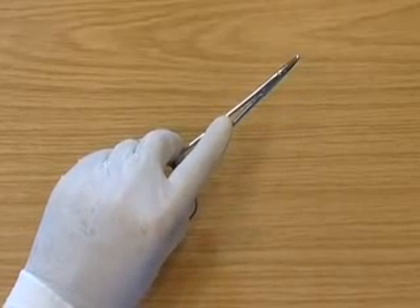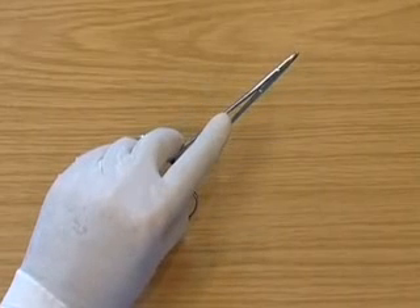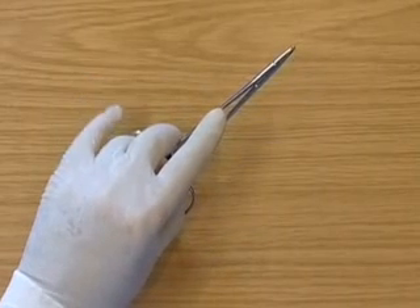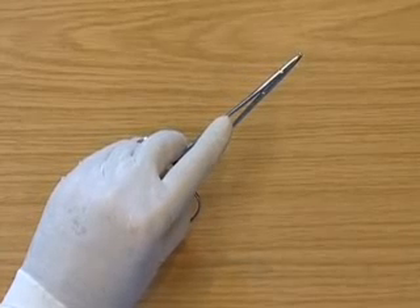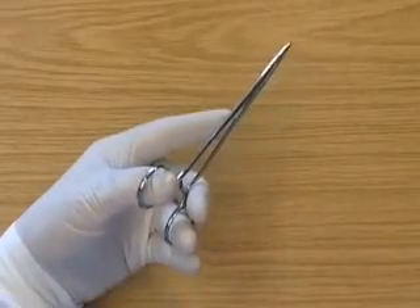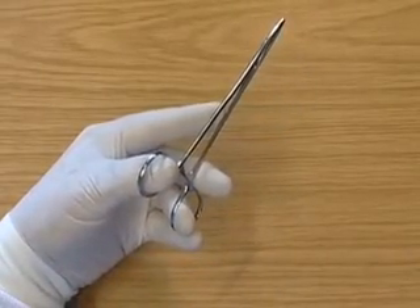Again, the first finger is directed down the holders, the second finger is supporting the holders and the third finger is supporting the holders. The balls of the fingers and thumb should be resting against the rings of the needle holders.